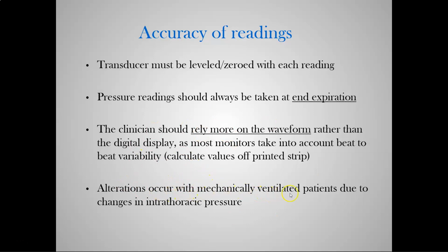Lastly, alterations in mechanically ventilated patients due to increased pressure. That's a big one. I think a lot of people forget the minute we introduce any kind of positive pressure ventilation, and I don't mean just vented patients. I mean patients that have any form of positive pressure coming into them, whether it's CPAP, BiPAP, bag valve mask, or in this case, a mechanical ventilator, you have increased thoracic pressure due to the volume and pressure being asserted by the machine.